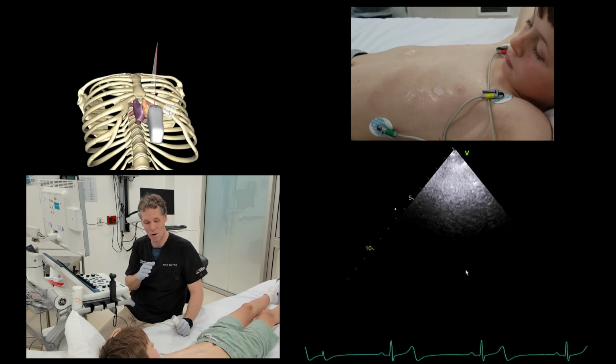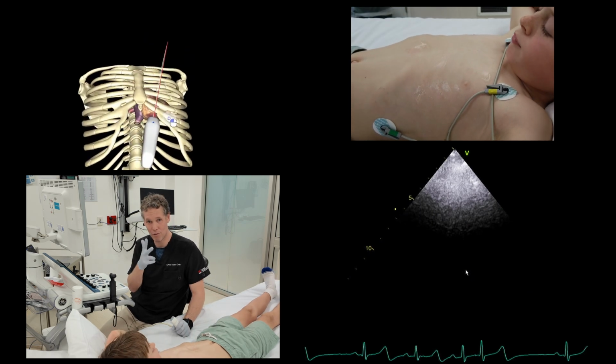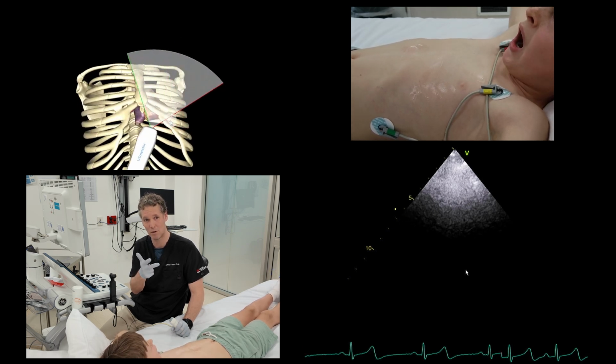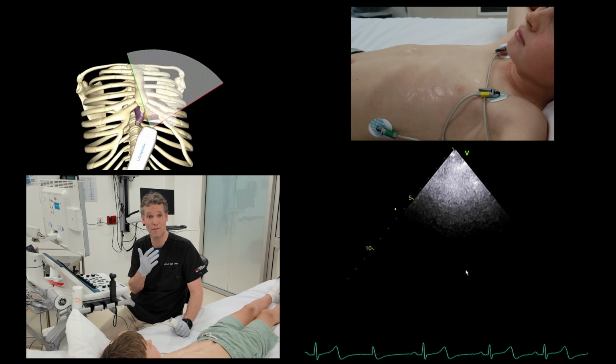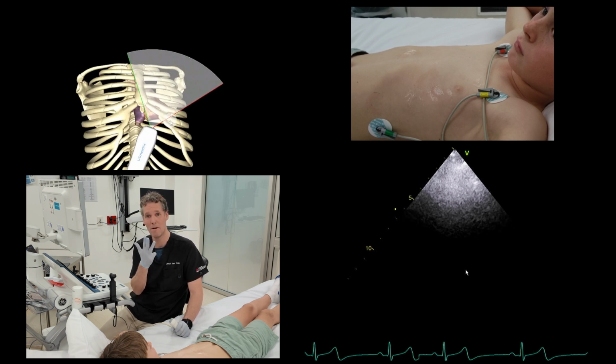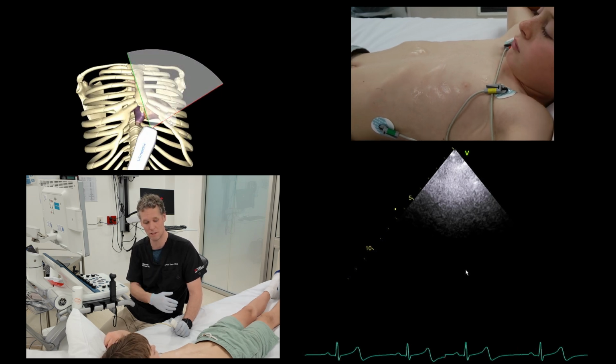So in summary, you've got 3 places, there's 3 acoustic windows: parasternal, apical, and subcostal. And you've got 6 different types of scans that you can do: your parasternal long, parasternal short, apical 4, apical 2, subcostal 4, subcostal short axis, and then the IVC as well.